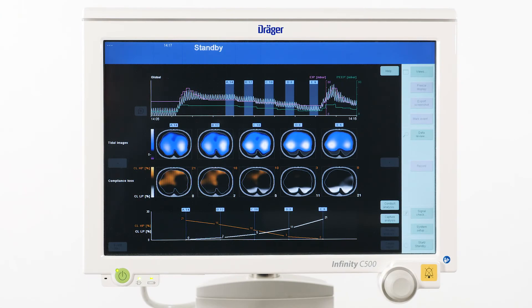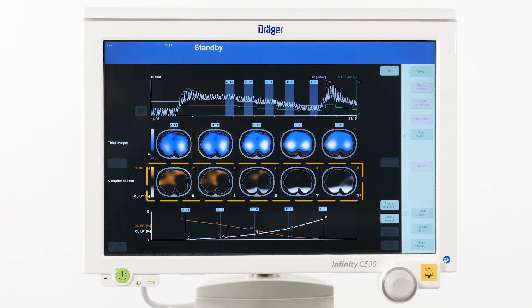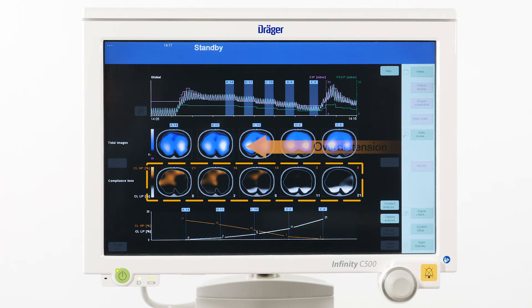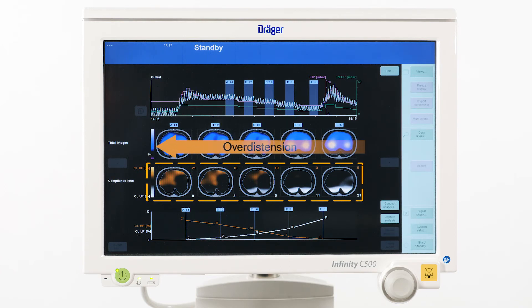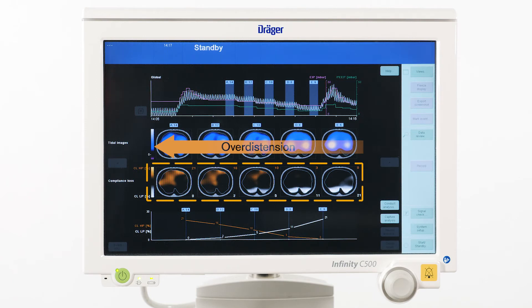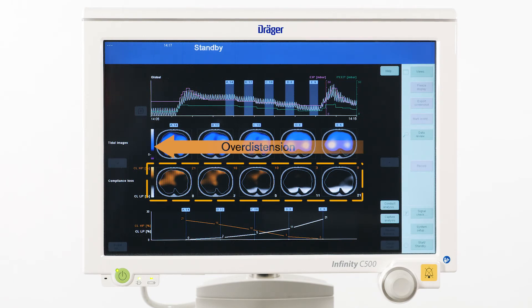But this onset of recruitment gets even more obvious in the series of images below. Here the loss of regional compliance toward higher PEEP levels, which indicates overdistension, is displayed in orange color.